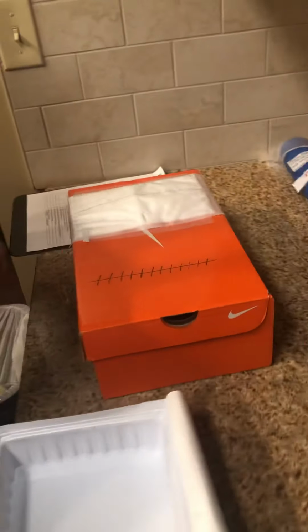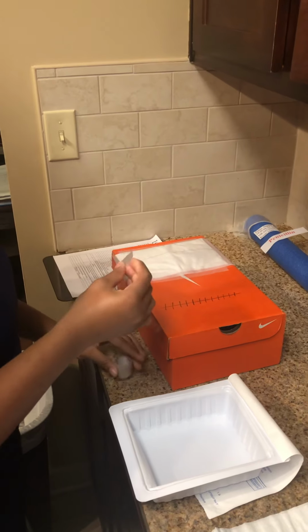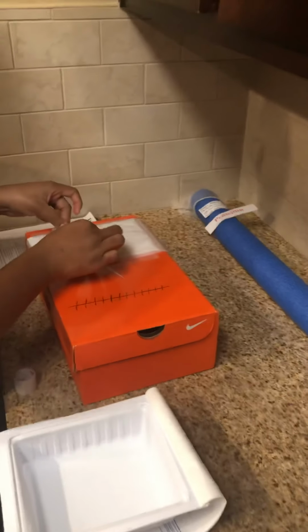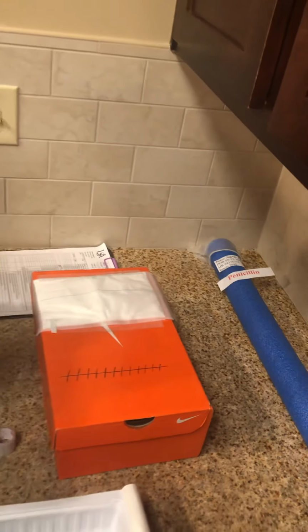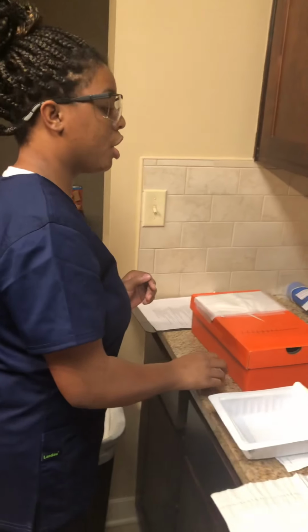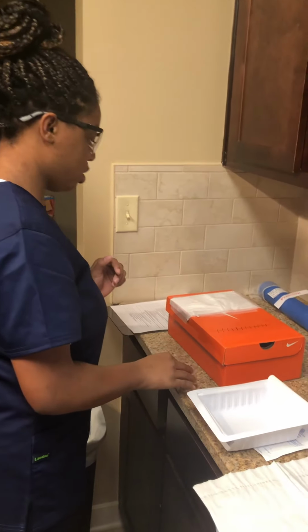I will now place a piece of tape in the middle of the dressing. I will label it with my initials, the date, and the time, so that they know who changed the dressing last and when the dressing was last changed.